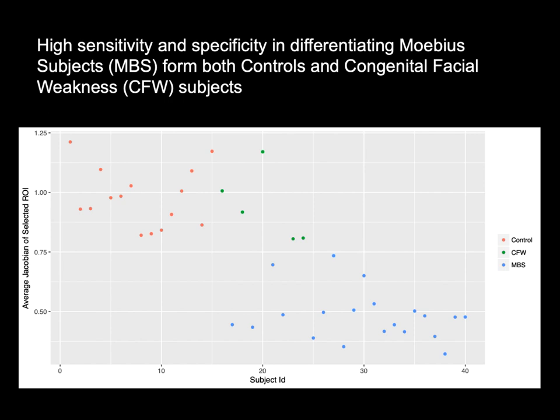So here, where you have your Jacobians all around one for the controls, this is with the control template, right? If you had a common one, yes, because this is true. But this one is where we actually, I do not remember if the controls for the classification were another group of controls. For the Down syndrome study, for instance, we did exactly that. So it's around one for the controls, but we have a completely separate population of controls.